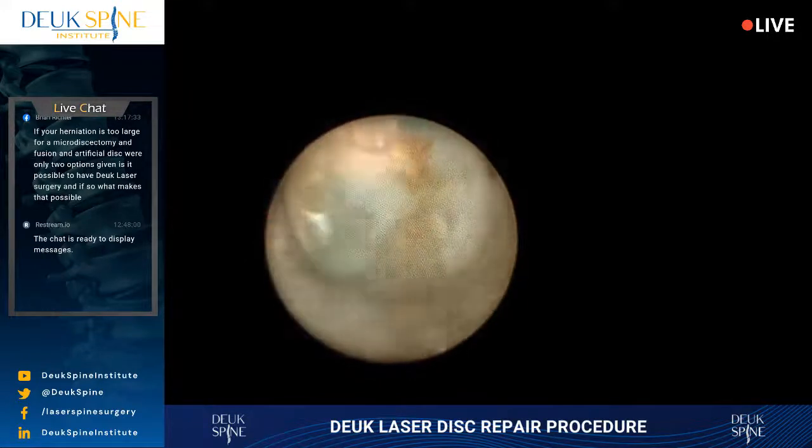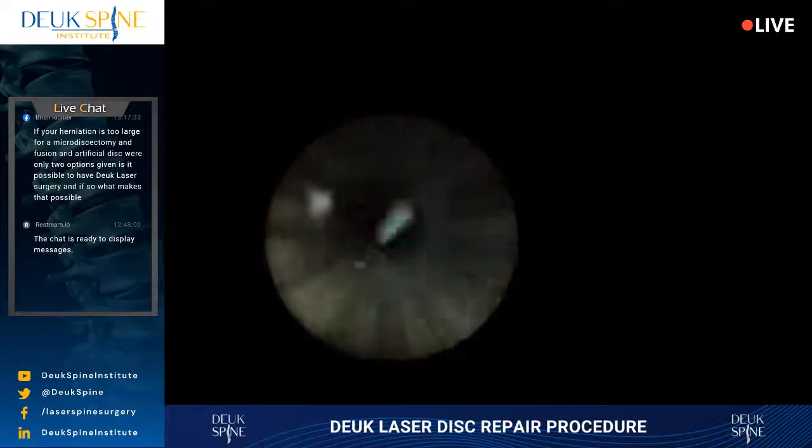All right. So this is all, well, nice, subligamentous disc herniations.